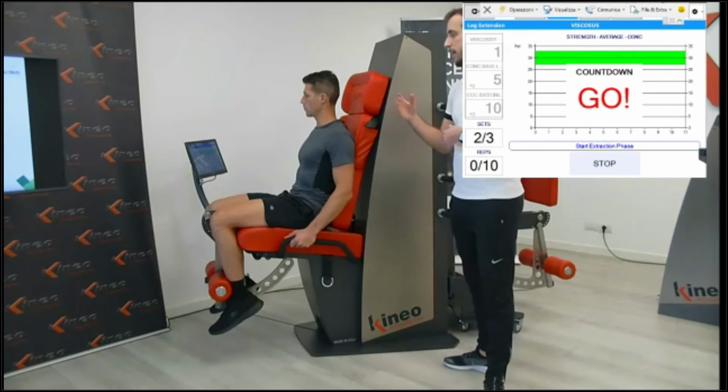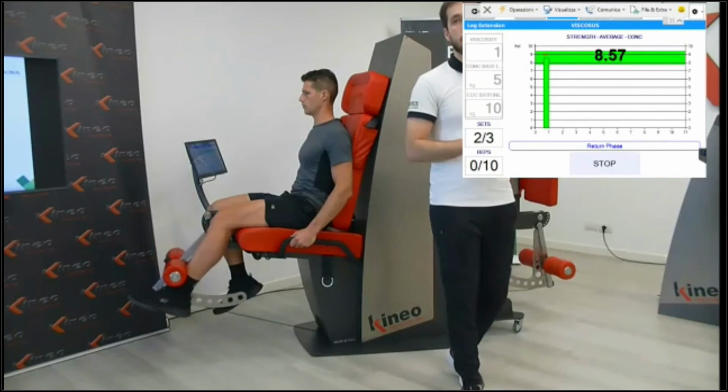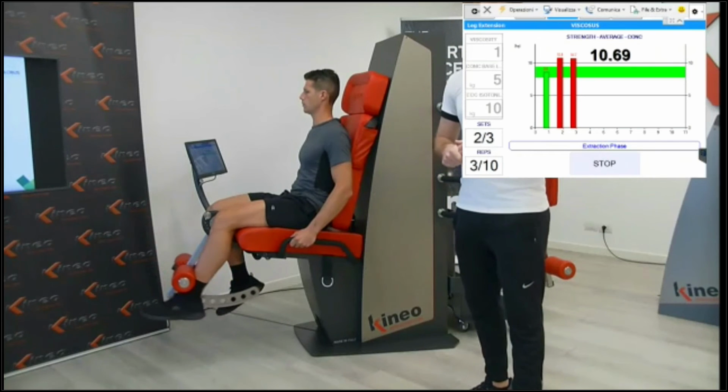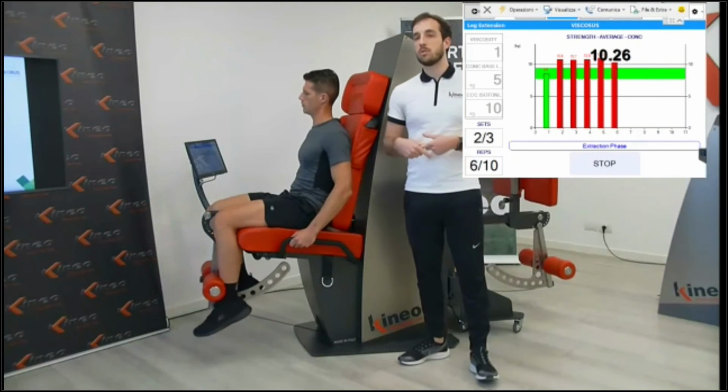Okay, so next execution, we continue with the next series and try to move faster. Try to move faster, quindi un po' più veloce. So now I ask him to move faster. All right, 8, 10 kilograms. As his execution is faster, the machine is giving him more load.